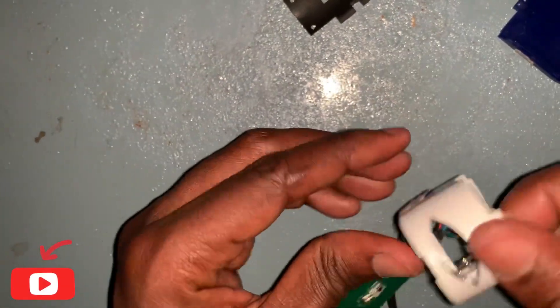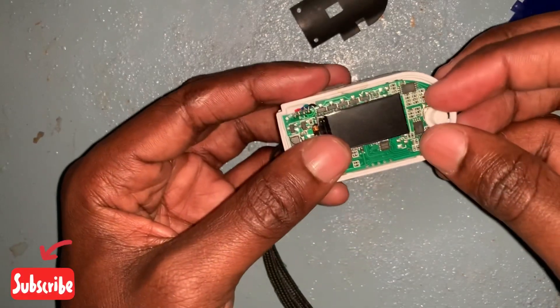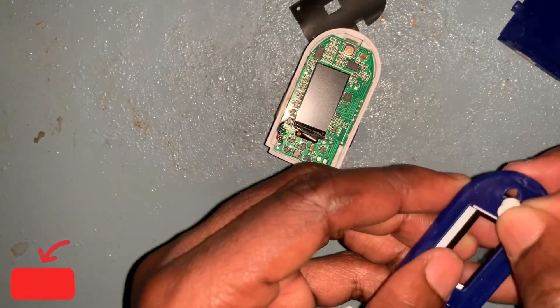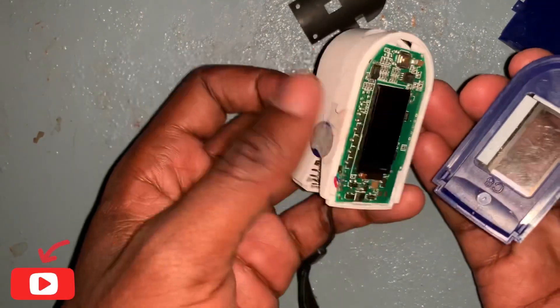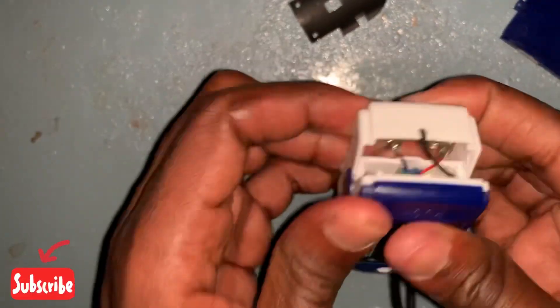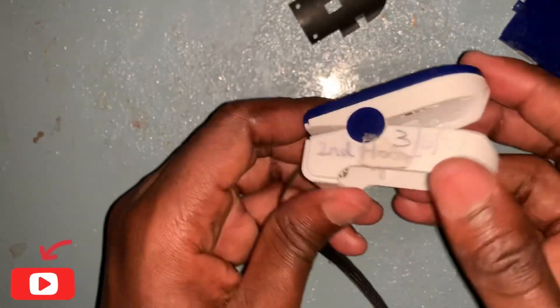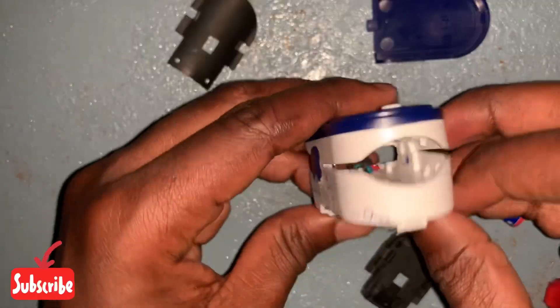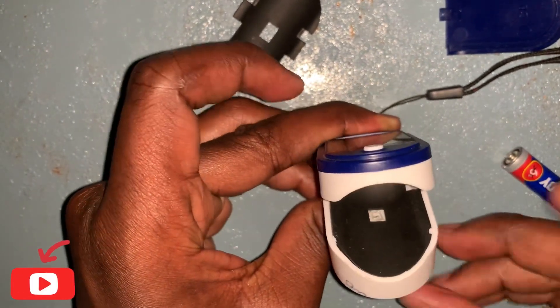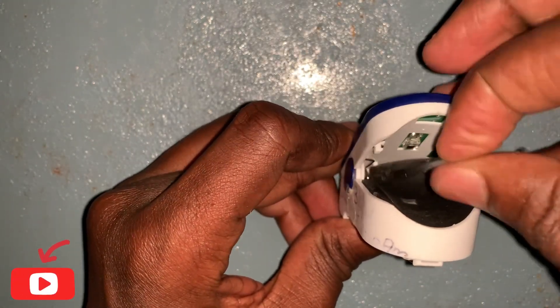Now what we do next is close this panel head, put the switch button in, and close it here. Then we put this hanger here — this one goes in here — and then we continue putting this piece in place.